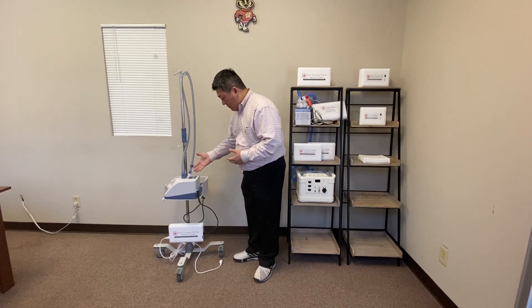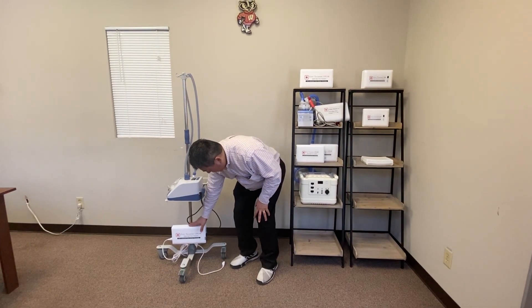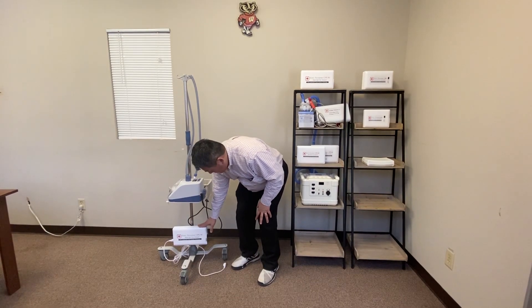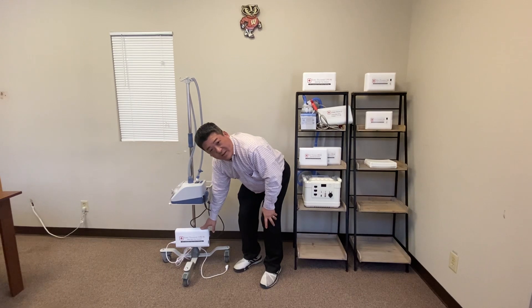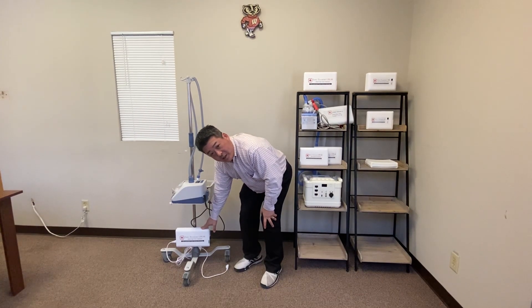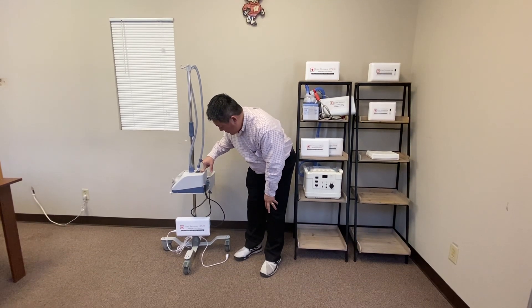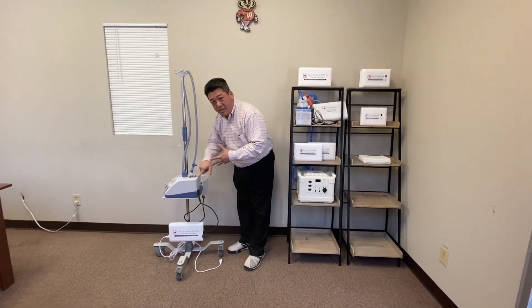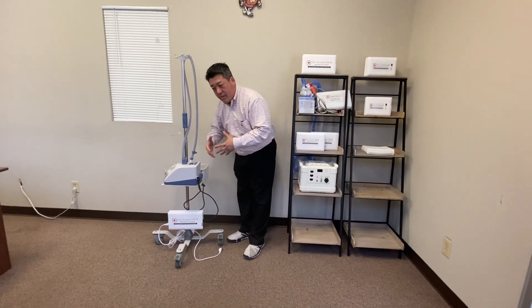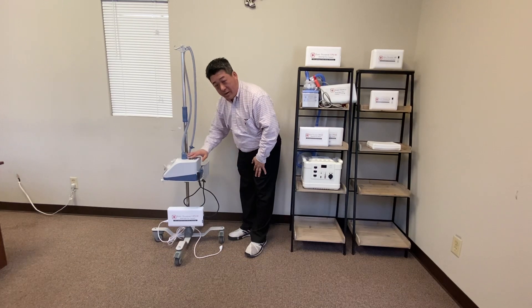Here we have an AirVo plugged in to the UPS 90. It's four and a half pounds and it lasts 90 minutes at maximum setting of 37 degrees Celsius and 60 liters per minute. Without plugging in, you can start the AirVo. It can transport for 90 minutes, so we have hospitals taking patients on a walk and even doing physical therapy with AirVo.